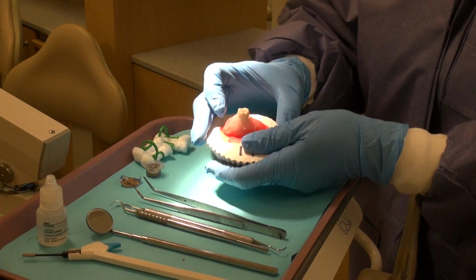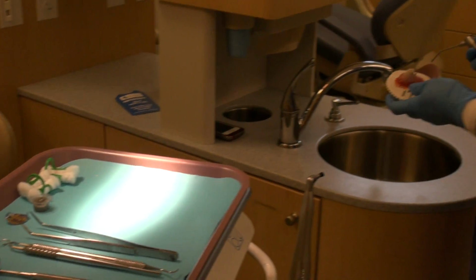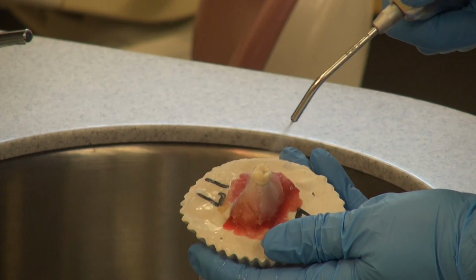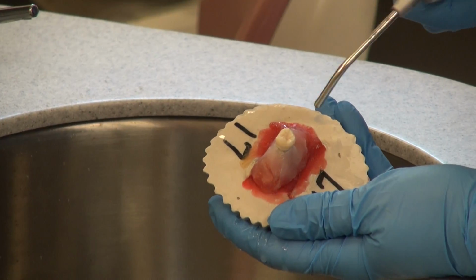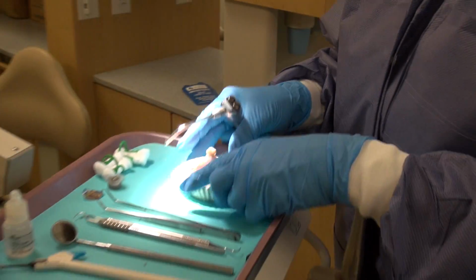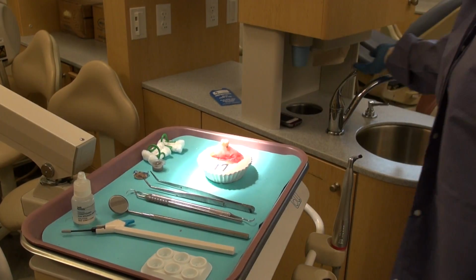After the tooth has been cleaned off the occlusal surface, we're going to take our air water syringe and rinse off the tooth of any pumice. Now, of course, when you do this in the mouth, we're going to be using a saliva ejector and an HVE tip to remove all of that debris that we are washing off.